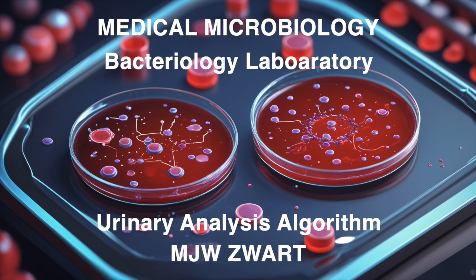Because it selects for gram-negative bacteria and differentiates lactose fermenters, which can be really helpful for identifying those common urinary pathogens. Exactly. So it's like using a targeted approach instead of casting a wide net. Right, you're focusing your resources on the most likely culprits. And this selective approach not only saves resources, but it also helps prevent overgrowth by normal flora, which can sometimes mask the presence of true pathogens.